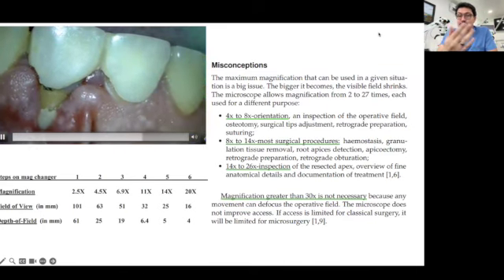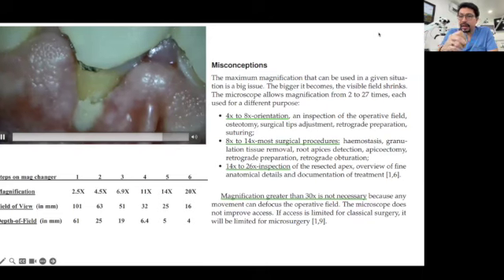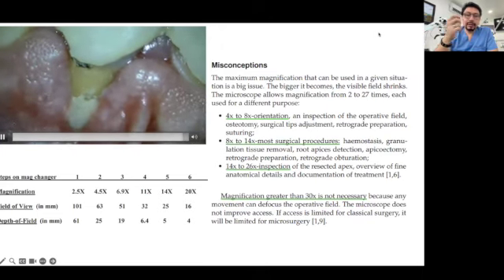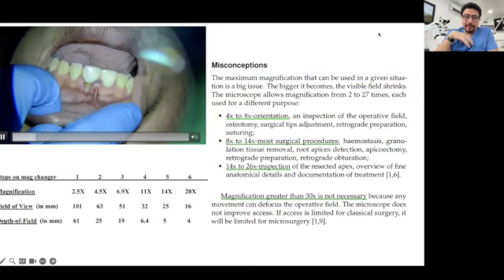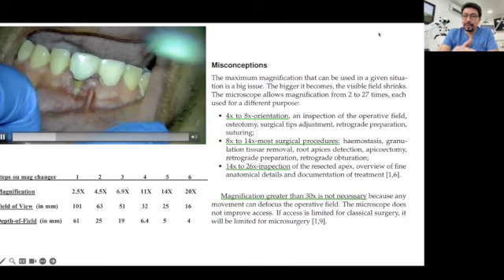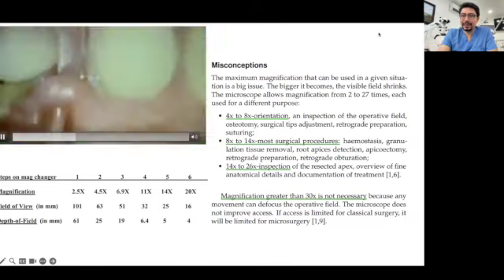For general procedures, preparing a tooth for a direct restoration, a root canal treatment during the instrumentation and irrigation process, or preparing a tooth for a crown, work between the second and the fourth magnification, but never go to the 5th and 6th level of magnification.